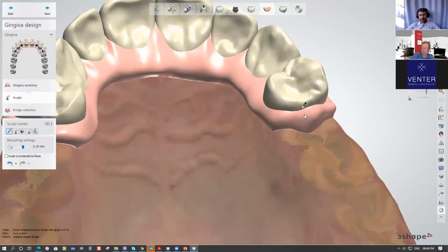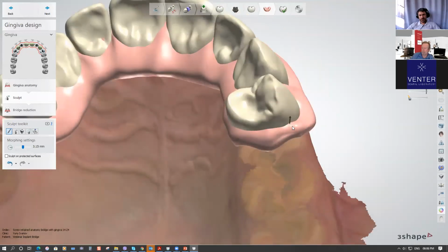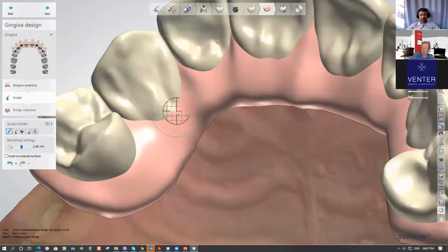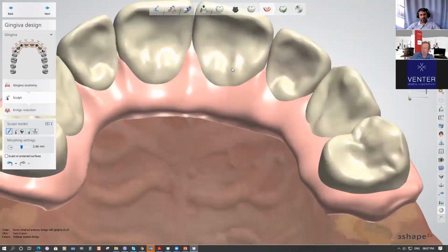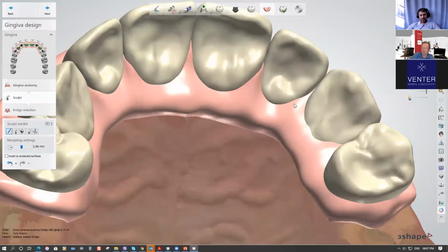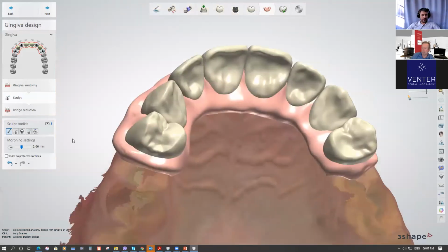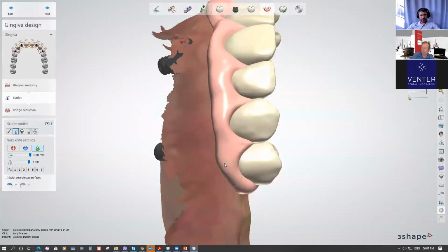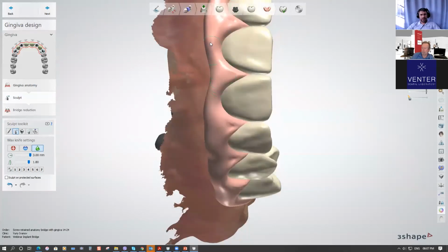And on the next step, we will have the cut back or reduction of the teeth. And reduction will start from the area of the connection of white and pink areas. It means we need to define where we will start our margin line for the future crowns. And this is the best way how to do it. It's just decide where the passage between white and pink will be here on this step. Also, we could use the wax knife to smooth all around if we need, and to make it a bit smoother.